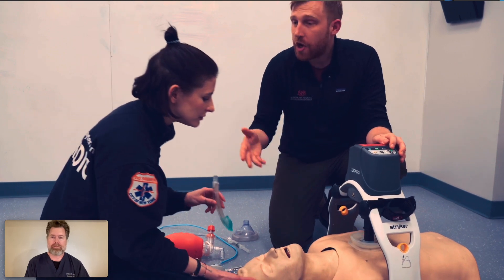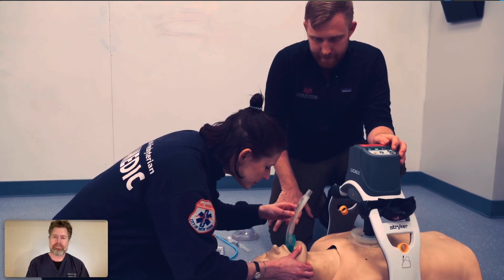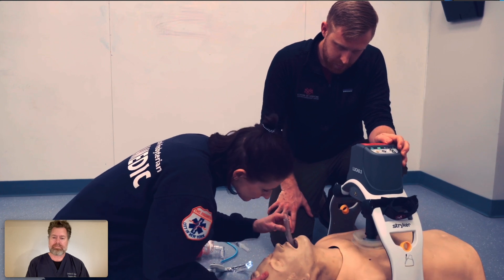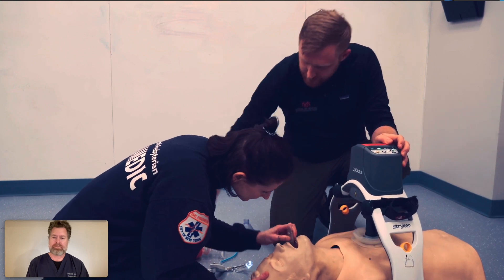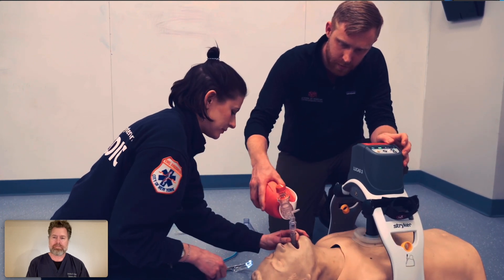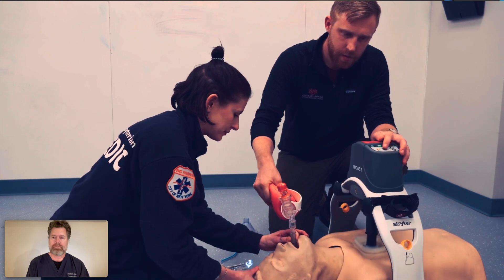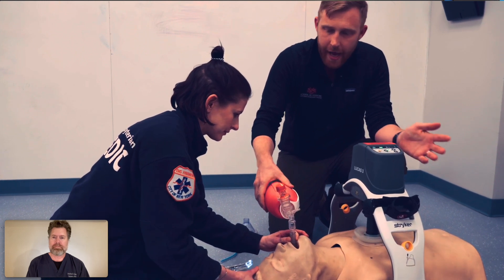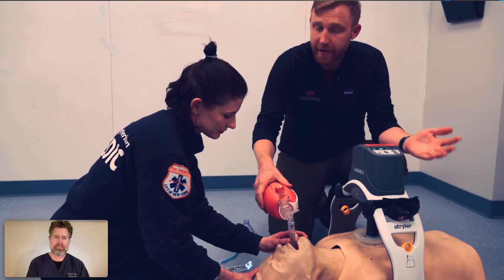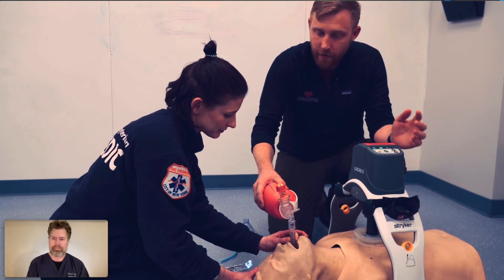Chest compressions ongoing — go ahead and place that. Now we can ventilate the patient and concentrate on the things that are actually going to help them recover from this cardiac arrest.